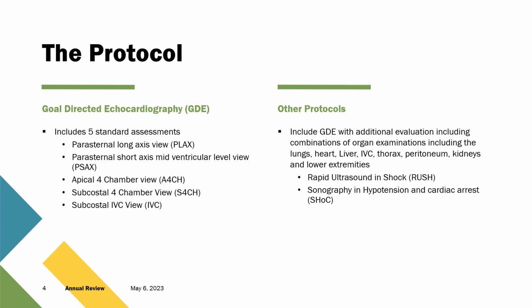So one of the protocols that we're going to talk about is the basic GDE, or goal-directed echocardiography. Now, the GDE is going to have very similar views to a general echo, but it's going to look at some of the detail in less depth, just because you're looking for specific goals to either count in pathologies or count out pathologies in a very rapid environment.